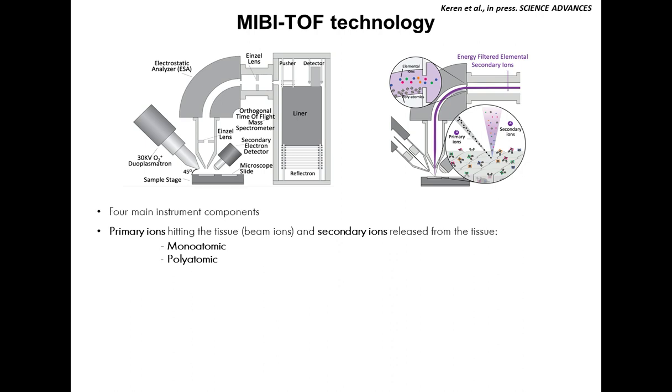So to be more specific, they are stuff that comes out from the tissue, clumps of atoms whose covalent bonds have not been broken, for example, because not much energy has been transferred to them, anything that has not been completely ionized, or maybe atoms that make adducts with organic material such as carbon, hydrogen, oxygen, or molecular conglomerates, etc.